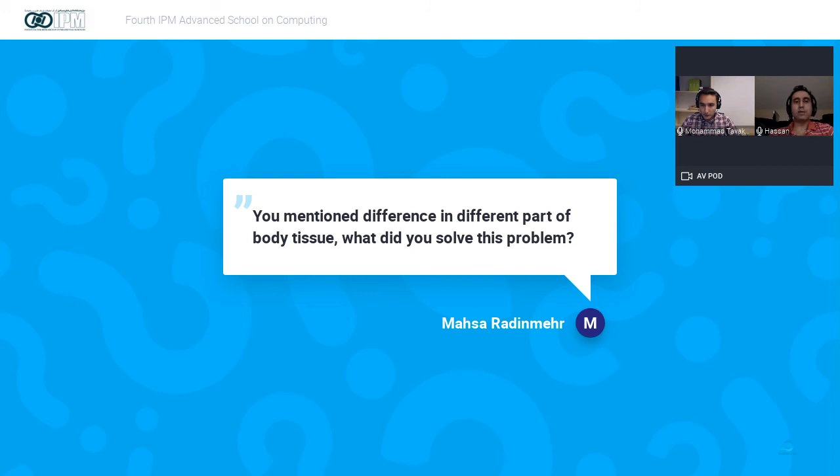So basically we sort of do the same. In medical imaging, usually each organ has its own body of research. You see a lot of literature on prostate segmentation, and a lot of literature on breast tumor segmentation, which may be using similar techniques. But because of these challenges that I mentioned, often you don't have a ring to rule them all. For every application, you need to fine tune your technique. So for different tissues, you need different techniques.